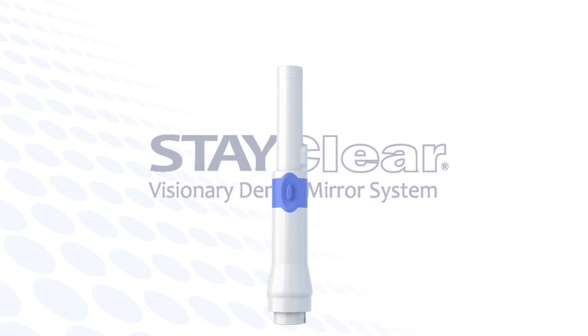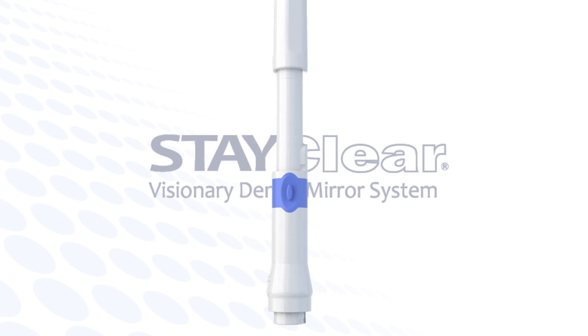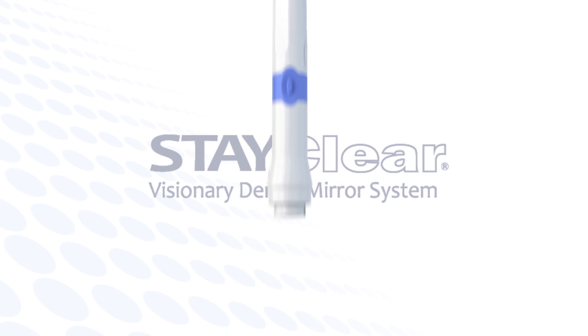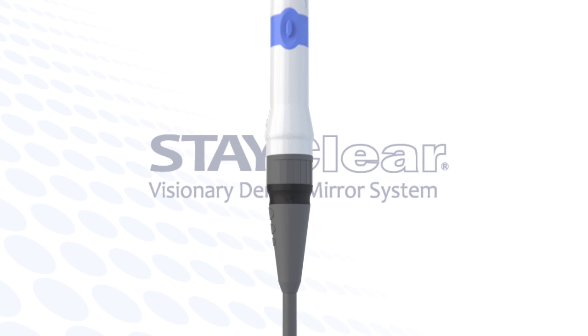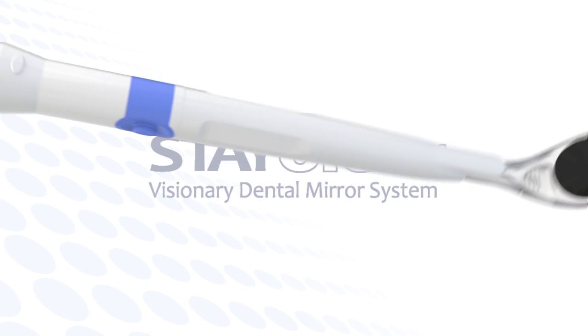Hold the StayClear handpiece. Note the computer-controlled button on the bottom side. Next, connect the assembled mirror, sheath, and handpiece into the StayClear umbilical that delivers electricity into the computer-controlled LED inside the StayClear handpiece.